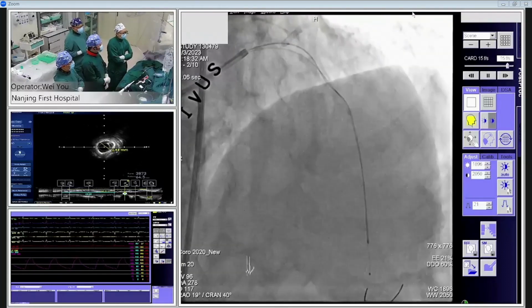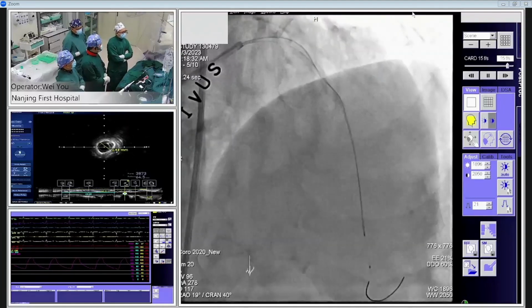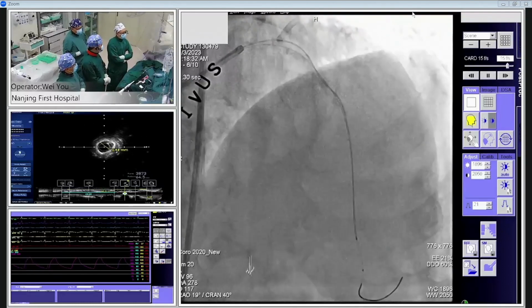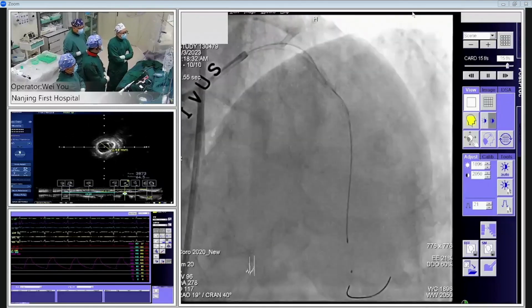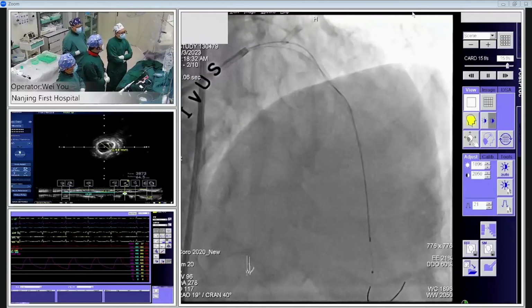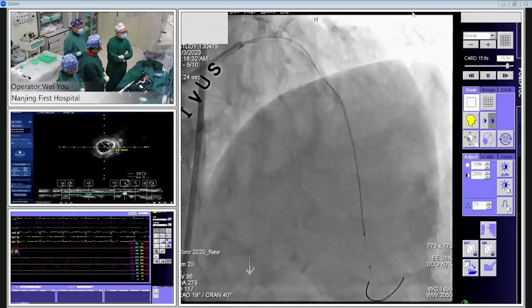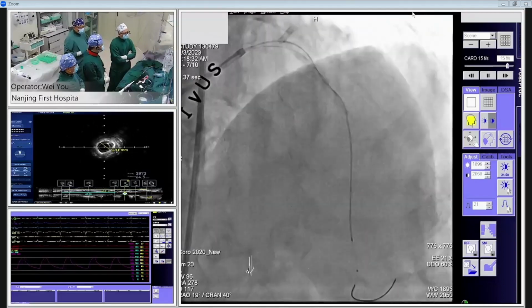So Dr. Yue, for these typical severe calcification lesions, before you plan to put a stent, the calcified lesion preparation is very important. For this lesion, what's your strategy? Will you use only cutting balloon or NC balloon for the predilation, or will you use rotablation, or even IVL treatment?